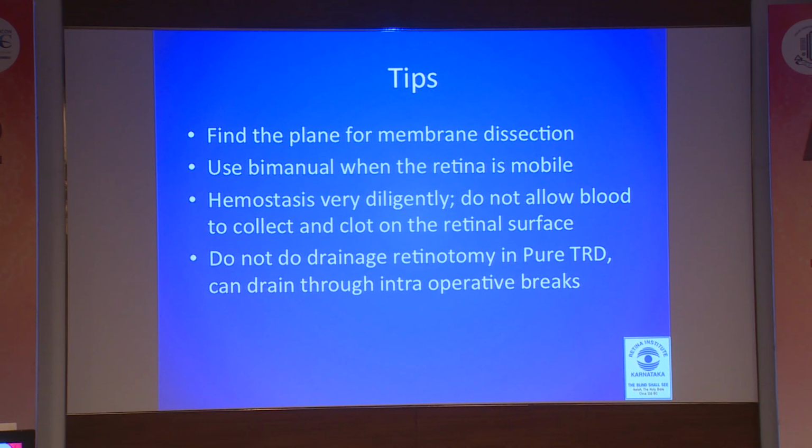Some important tips: finding the plane for membrane dissection is very important. I'll show you a video regarding this, because once you find the real plane, the membrane peels off from the retina very easily, and you just have to sever the minor connections. And whenever the retina is mobile, I switch over to the bimanual technique. I will show you a video.